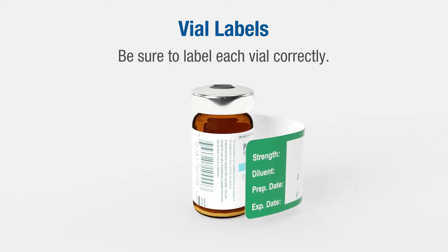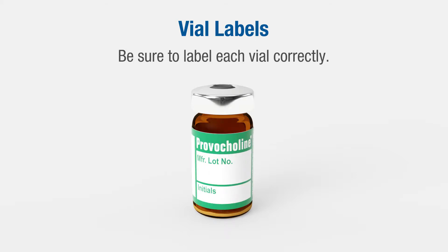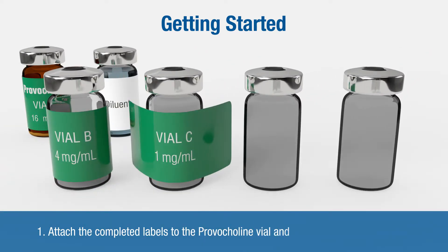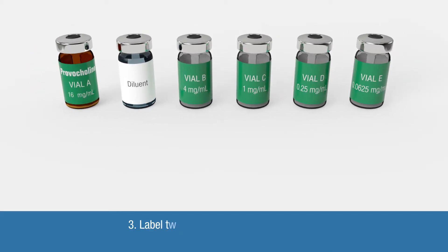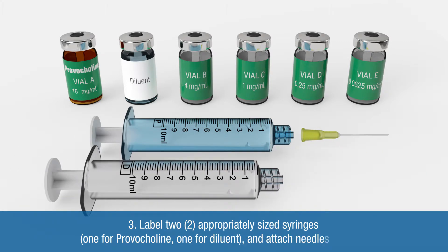Be sure to label each vial correctly. In this example we are using the vial labels that are included with the Provocholine that require the dilution strength, type of diluent used, preparation date, expiration date, lot number, and the initials of the individual performing the dilution. To get started, attach the completed labels to the Provocholine vial and the four sterile empty vials. Wipe down the stoppers of the Provocholine vial, diluent vial, and four sterile empty vials with alcohol preparation pads. Label two appropriately sized syringes — one for Provocholine, one for diluent — and attach needles to each.